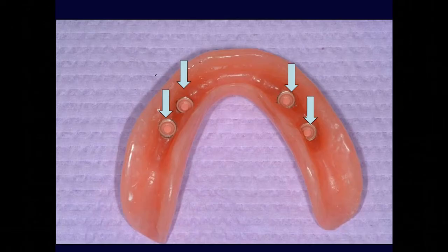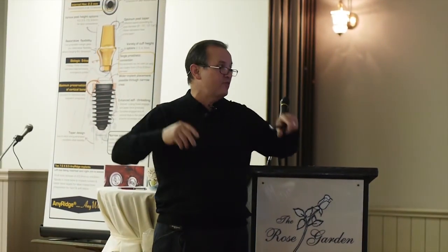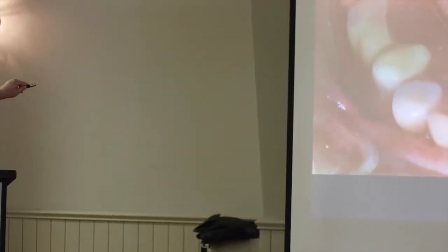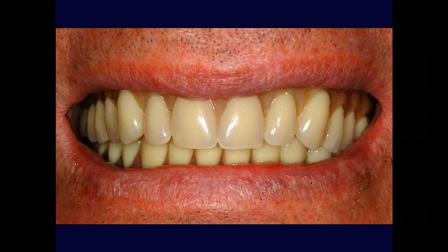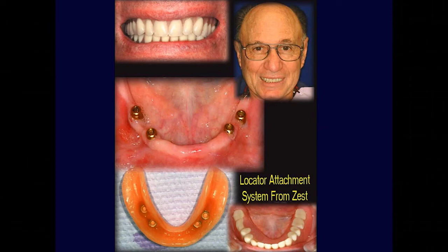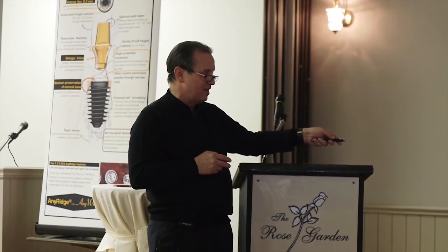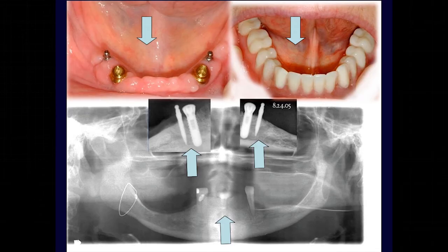This is the second case. This is a guy that had a bar overdenture, and the bar was so high up that it kept breaking through his existing denture. So we took the bar out, and you can see where that bar kept breaking through because there just wasn't enough room there. So we put these individual locators in, took his denture, relined it, and to this day we haven't gone back and made another one. He's just done fine with it. But it was one of those things where you start stacking components: you've got an abutment, then the bar, then the clip, and then the acrylic and the denture tooth. And sometimes you can violate the space to the point that you've got a prosthesis that keeps breaking. You see down here is where he kept breaking through that.